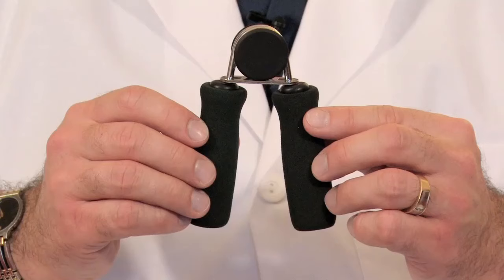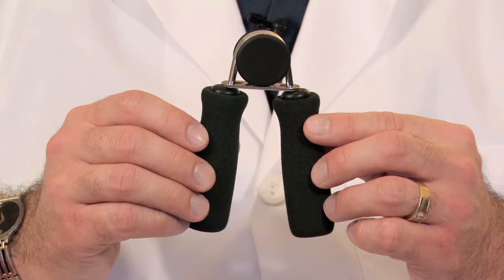Hello, I'm Dr. Robert Fennell with HandAndFootPain.com and today I'm going to show you how to use grippers. A gripper is an instrument or tool that's used to increase grip strength in your hand.